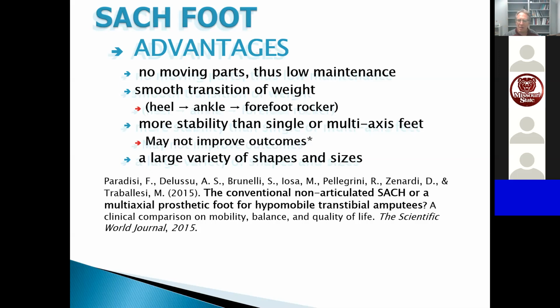Okay, so what this does better is shock absorption, because what plantar flexion does for us and other people with healthy sound feet is it's a shock absorption mechanism. And the actual plantar flexion of the prosthetic foot, it turns out, is a better shock absorption mechanism than just the compressing of the soft heel of the SACH foot. So what happens then is that because you've got a higher external plantar flexion moment, let me find my skeletal leg.